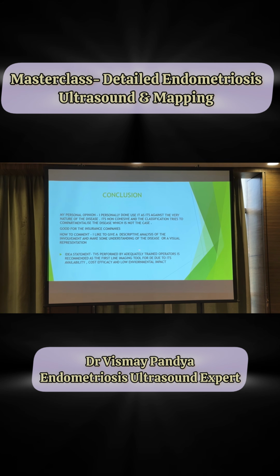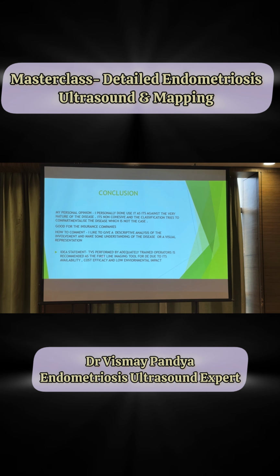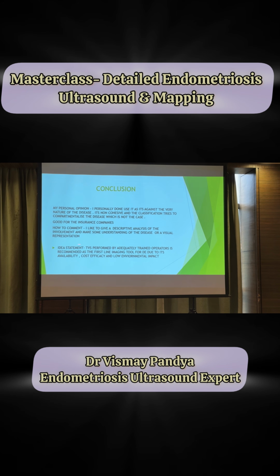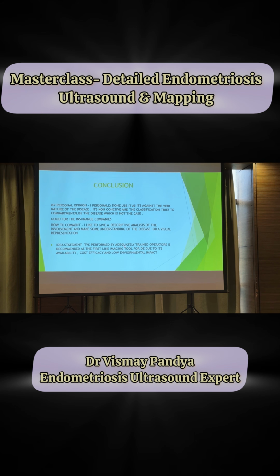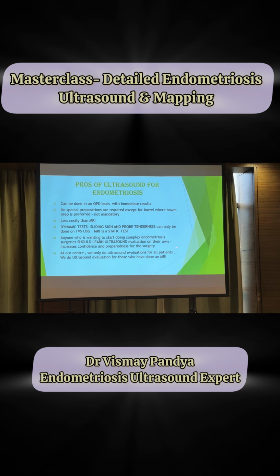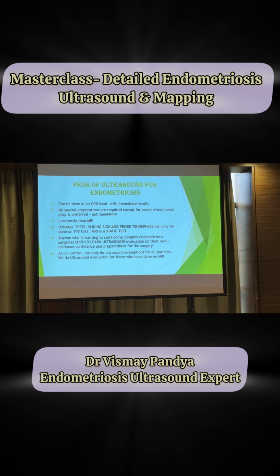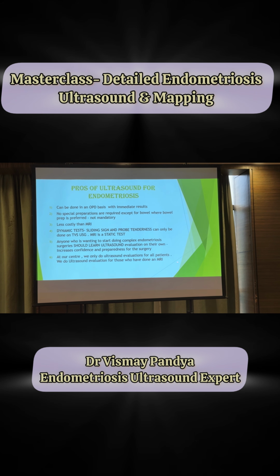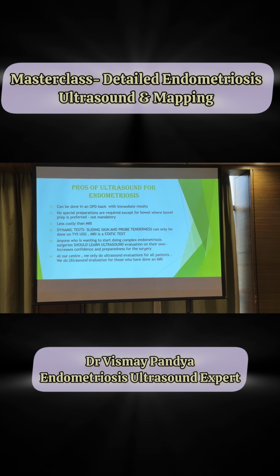But just one point: TVS performed by adequately trained operators is the first line imaging tool for deep endometriosis due to its availability, cost efficacy, and low environmental impact. I'm not telling it's the gold standard, it is the first line imaging at least. Pros I've already mentioned. We only do ultrasound evaluations for our patients at our center. Even if the patient has had an MRI, sir is so kind to refer all patients to me for ultrasound evaluation.